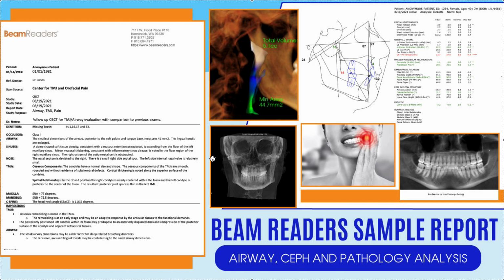If you have the CBCT and if you are taking it, you guys have to be using a service like this, because unless you know how to read these suckers, and if you can't read them to the level that this radiologist read it to, then you really have no business doing it, because all it takes is one, and you're going to be in some big trouble. So that's pretty much how it works.